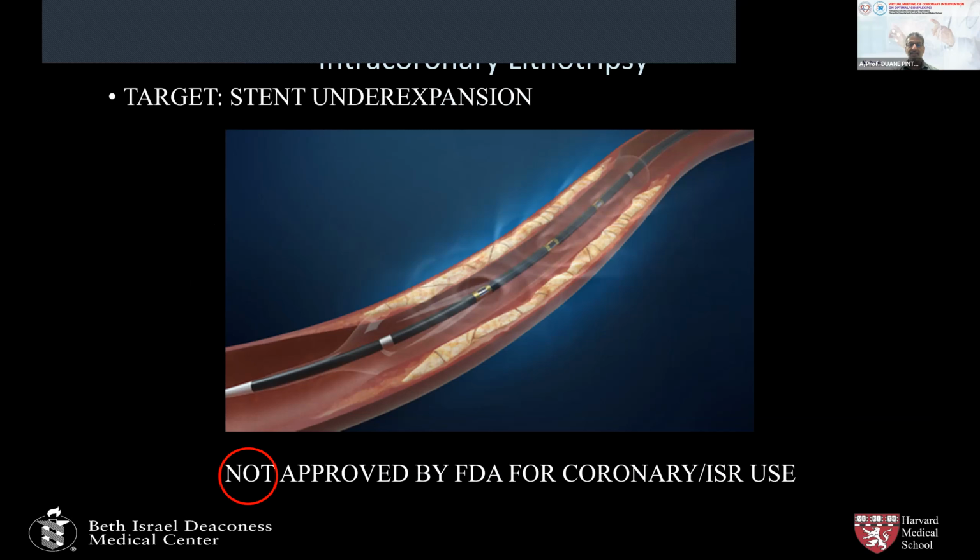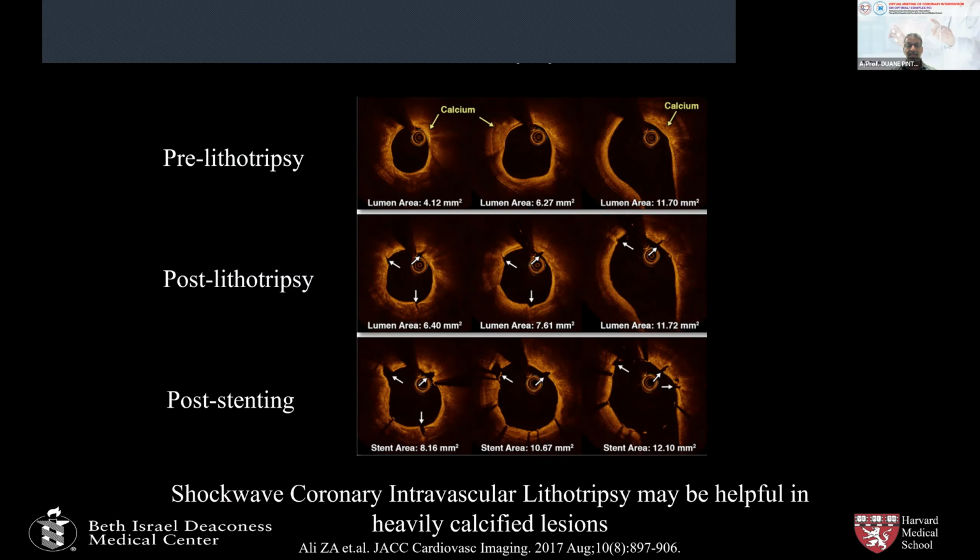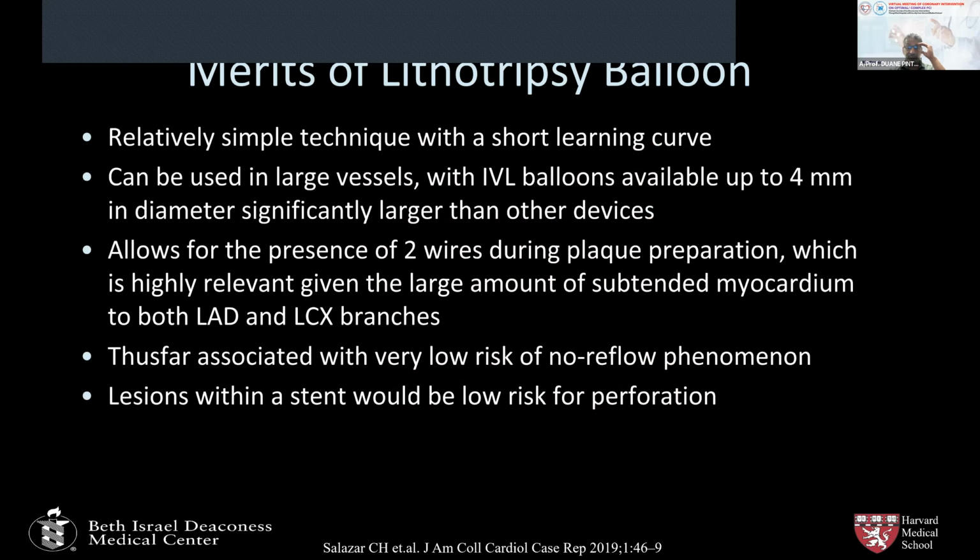It's not approved for in-stent restenosis. It remains to be seen whether this technology will allow us to open under-expanded stents. But here's an example of pre and post lithotripsy and post stenting in a case where shockwave was used to open a heavily calcified lesion and facilitate stenting.